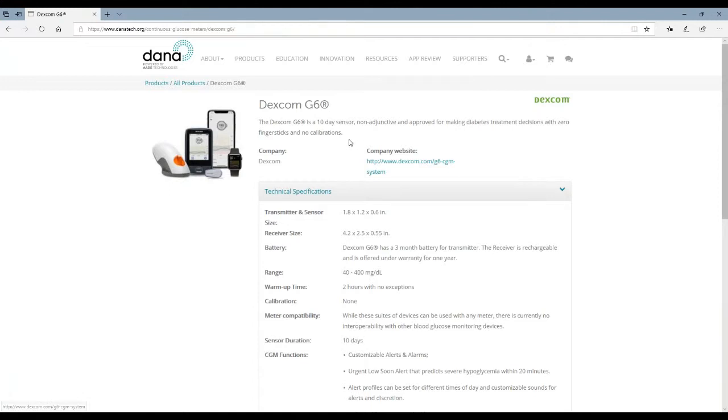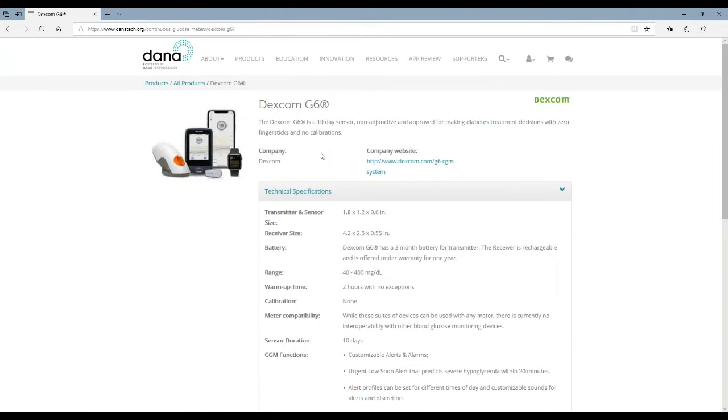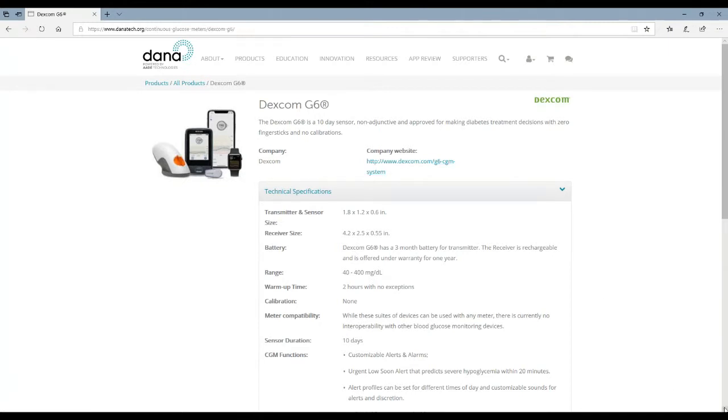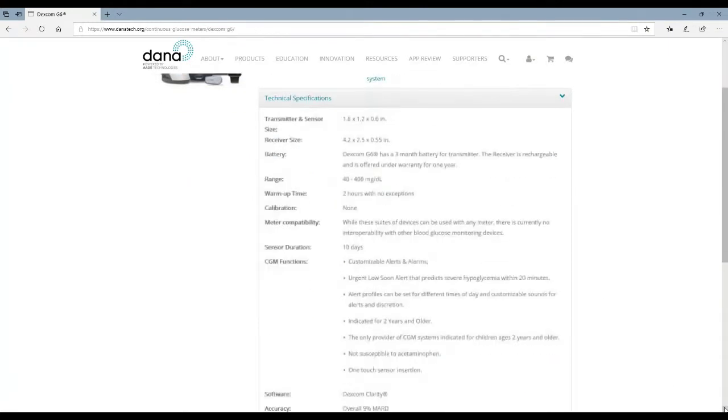When you click on the product itself you'll come in and see all the technical specifications. The great thing about Dana is everything is laid out the same way so once you've learned one type of product you'll see it's the same in every single one. Every single CGM is laid out the same way. You'll see a picture, the product name, a short description, a link directly to the company website, and then the technical specifications for the product.